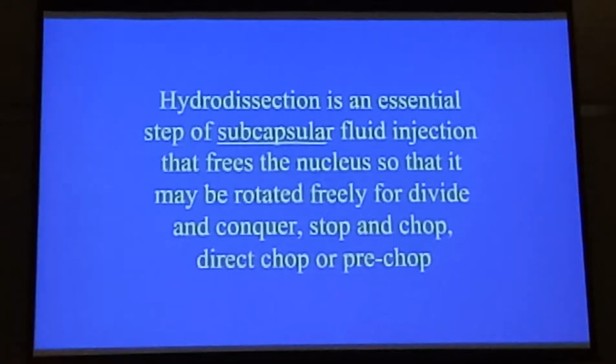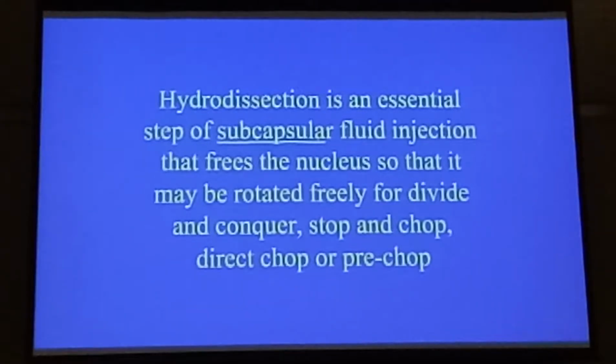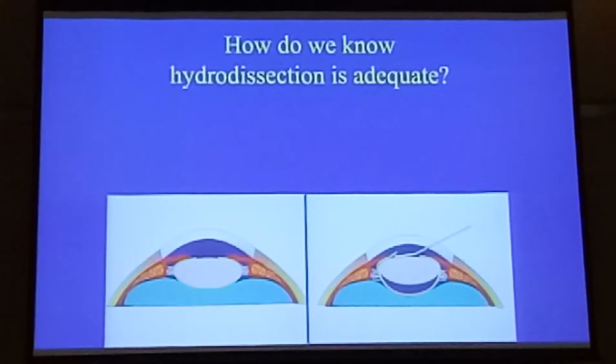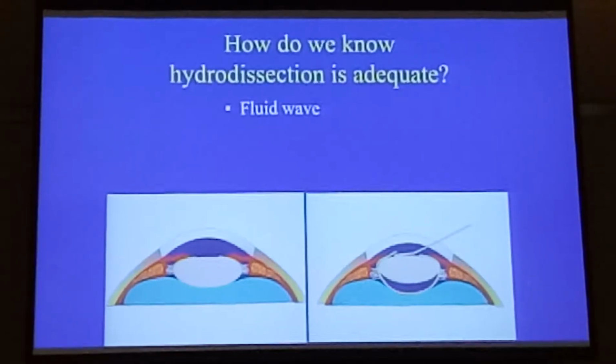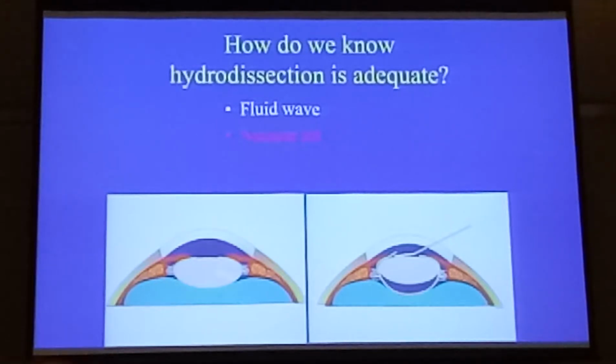Hydrodissection is actually a very important step. Subcapsular injection of fluid, PSS, so that you can free the nucleus, so that you can rotate it freely for whatever technique you want to remove the nucleus later on. Now, how do you know hydrodissection is adequate? I ask this question of all my residents. They all will tell me it's the fluid wave, right? But what happens if you can't see the fluid wave? Then I think there are two other very important signs, one of which is the nucleus coming up, the nuclear lift. And also, sometimes if you do it too much, the nucleus prolapses out of the capsular bag.